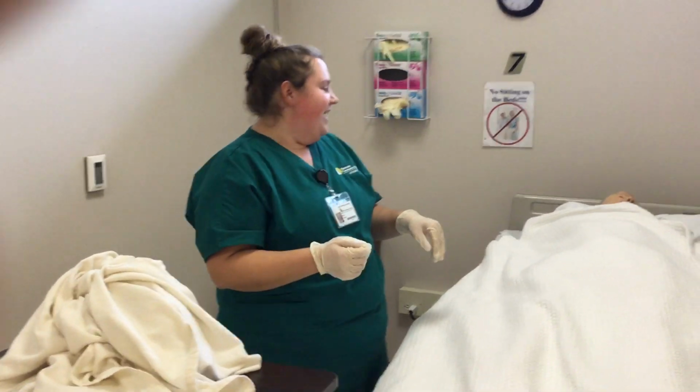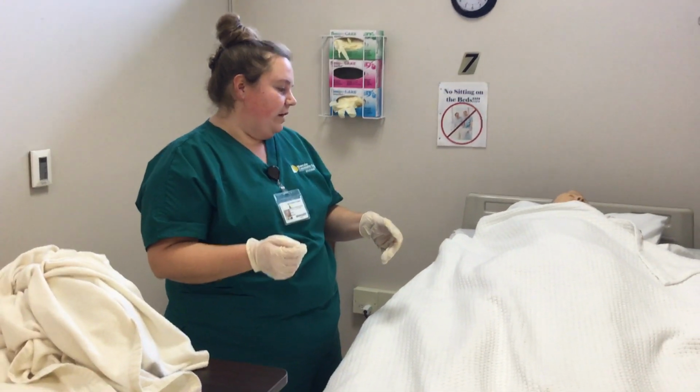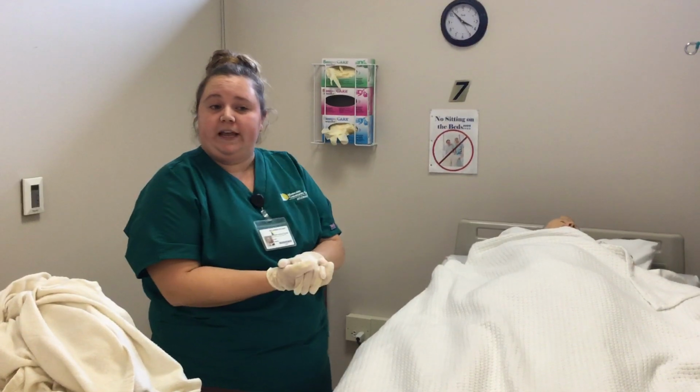Sorry, that took a minute. Yeah, check for any leaking, and yeah, that's all.